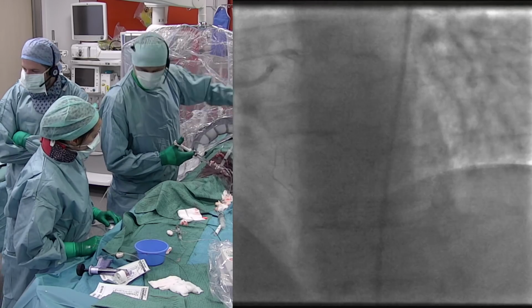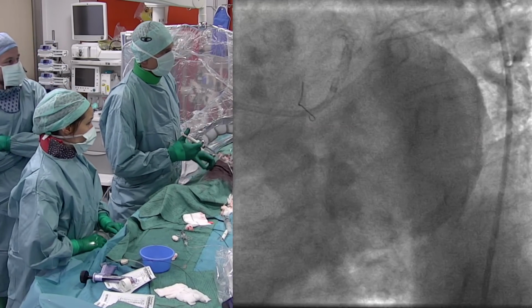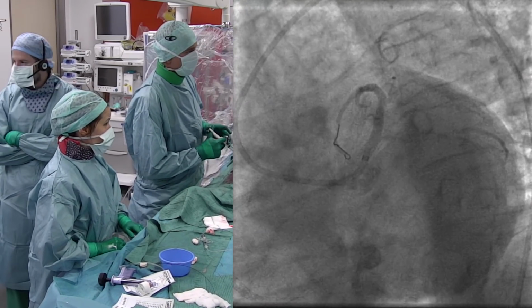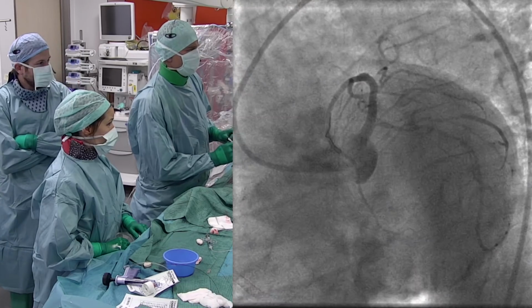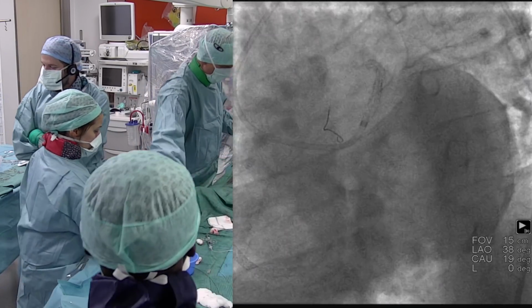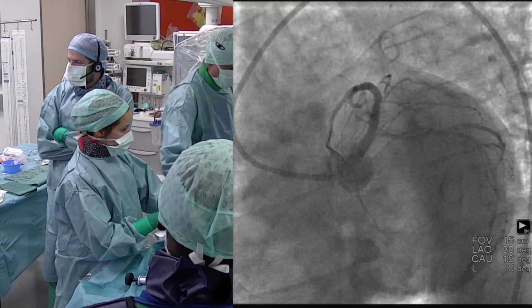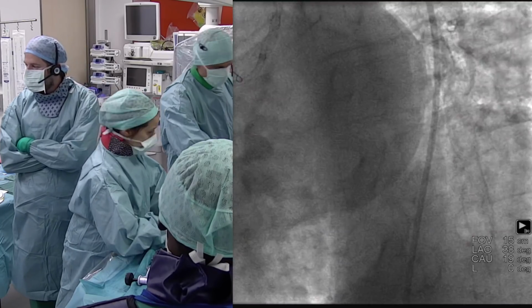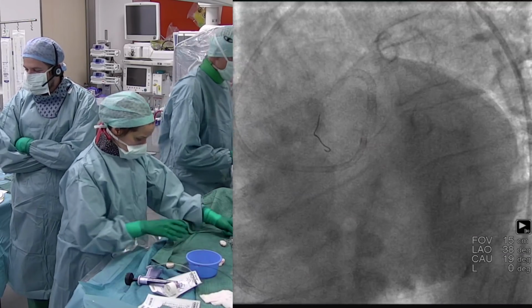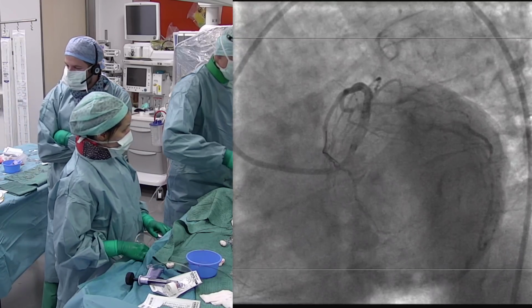Yeah, so my practical consideration, of course, angiography is a very good tool to use for sizing. It can be a good tool for such cases, as you mentioned, if you don't have access to any of these techniques. But for instance, as I said at the beginning, understanding the functional importance in a patient after anterior MI is very difficult to define simply based on any morphological measure.